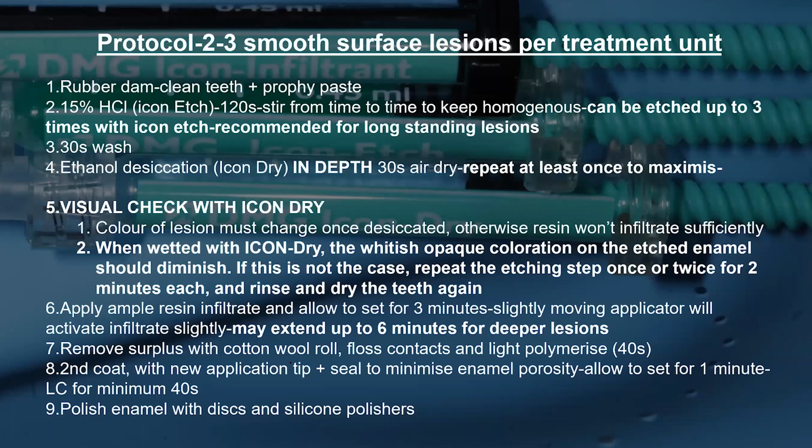I kind of do this quite a lot with a number of instructions. We use a number of different materials, and they've got very specific timings and how you use them. And I find it just helps to have this on a Google document, or you could print it and have it laminated in surgery, or just something to refer to. It helps you to know what you're going to do, when you're going to do it, how long you're going to do it for, all those sorts of things, and just makes life a lot easier. It's difficult to remember all these things very specifically, so the easier it can be, the better.